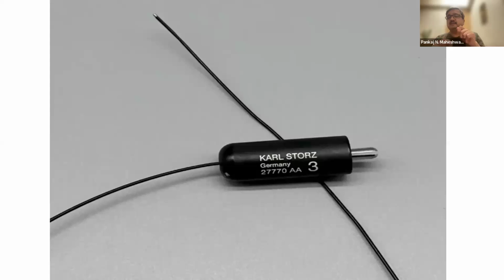There it was a pinion, means there is a small handle below which you can move front and back so that the loop moves. So it is just a historical novelty you should know, but otherwise no significance today. You would not see it in any say instrument trolley.